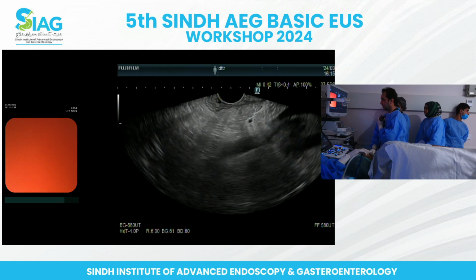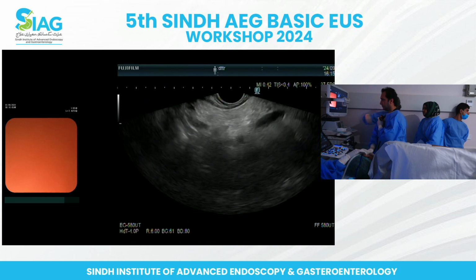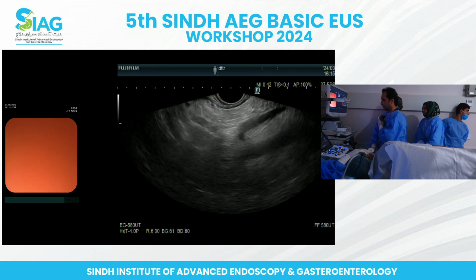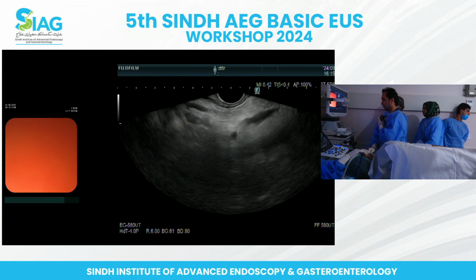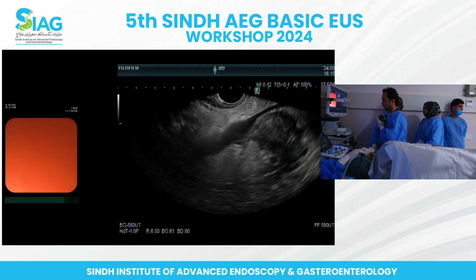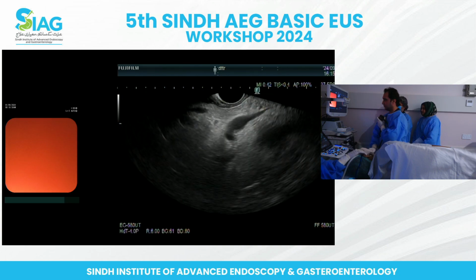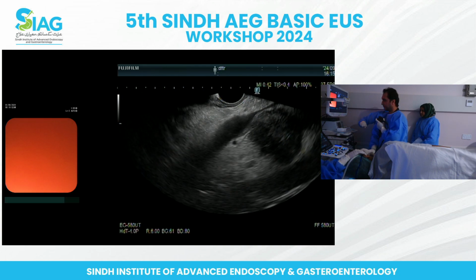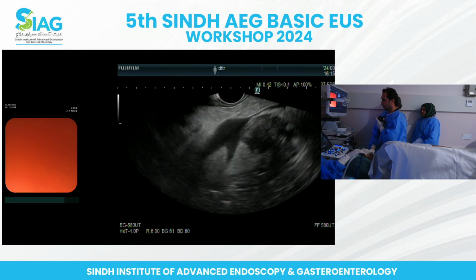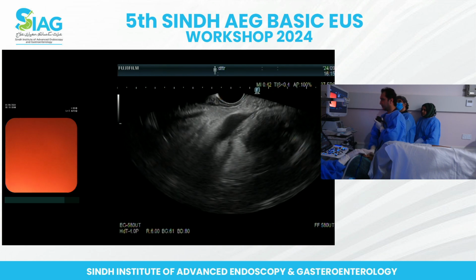Yeah, very nice. So the mass is coming here. You just saw the mass there. And actually all of a sudden you see the bile duct leading into it. But we need to get it in a way where portal vein is not in there.